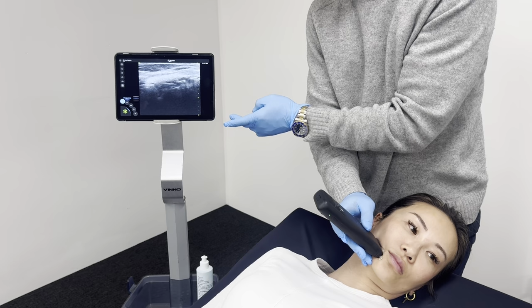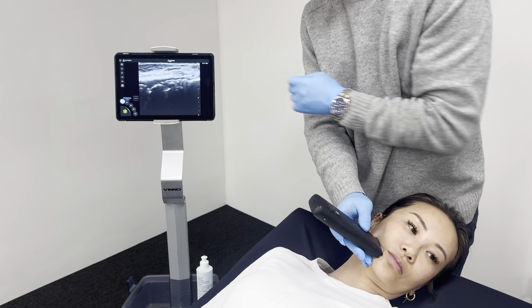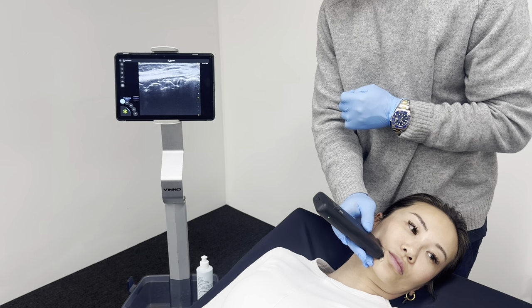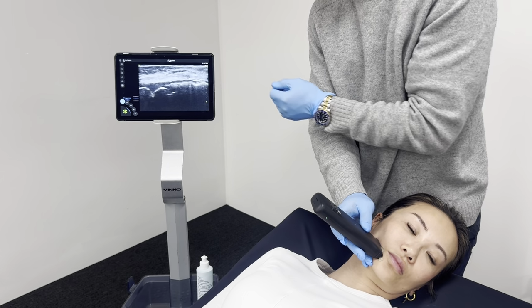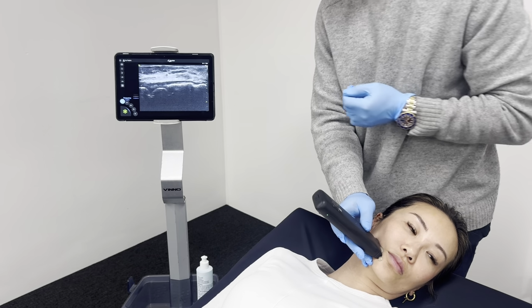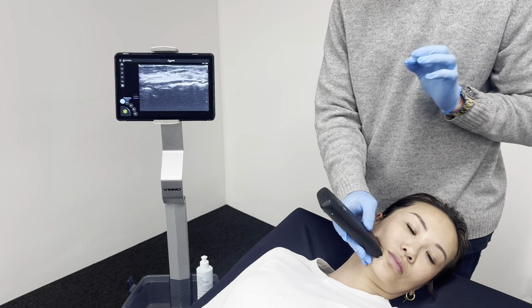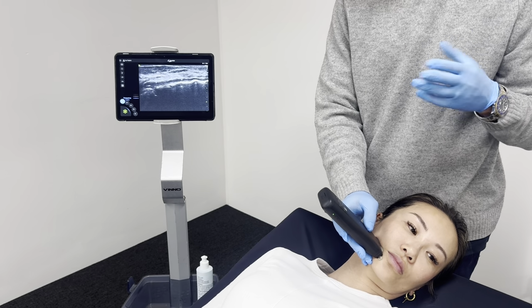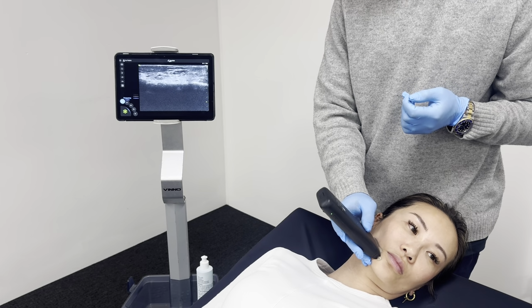And above that, I'm going to get a cross section of the DAO, which is this muscle, this dark semicircular muscle in the middle of the image at the moment. So I can probably make that a little bit bigger just by adjusting the depth again. The other thing I'm going to do is adjust the frequency, and we can just use the slider on the left hand side of the image there. Adjusting the frequency, increasing it, gives you better resolution. Sometimes it gives you worse penetration, but for the face, that's typically not an issue.